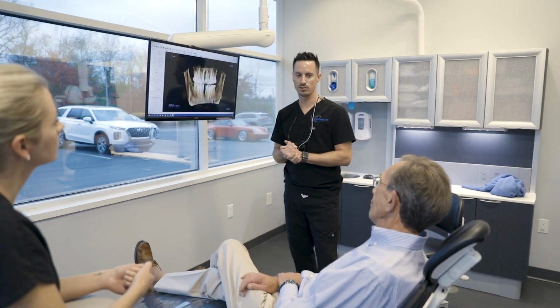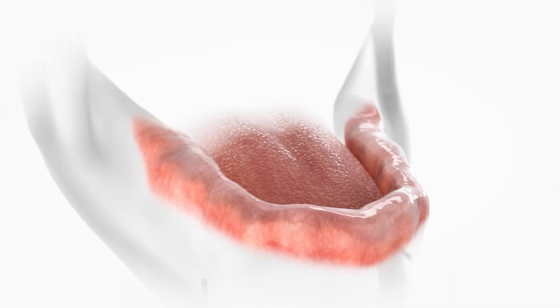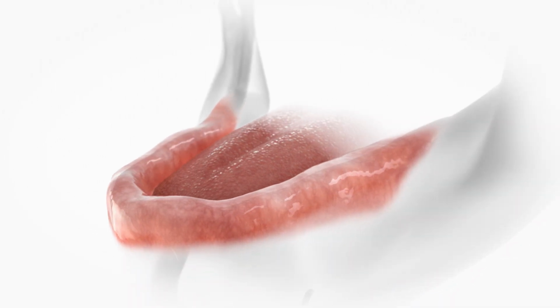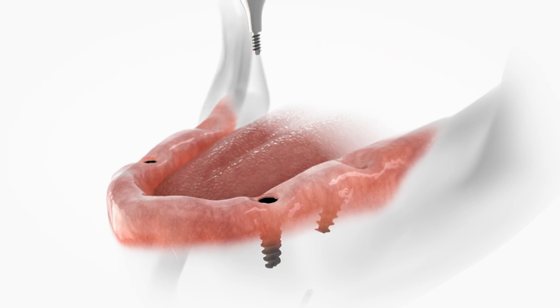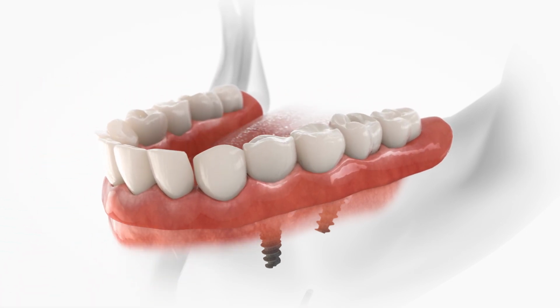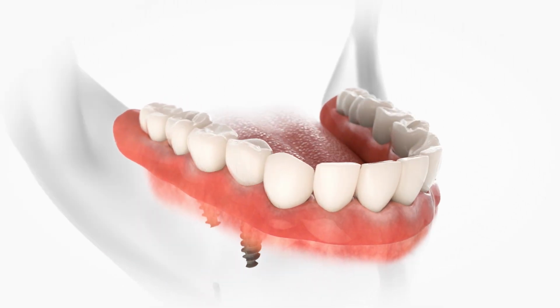A lot of patients will leave with their final prosthesis within 3 to 4 months. That's typically my goal, and this is in a healthy individual. We're going to place those implants. They're going to integrate within that bone. They're becoming part of your body. And in a 3 to 4 month time frame, we are designing your final case, and we're going to 3D print our try-ins to verify our end aesthetic results before we mill the final prosthesis.